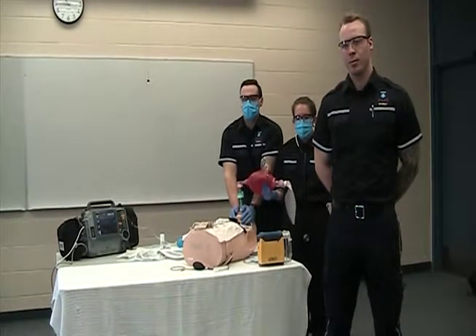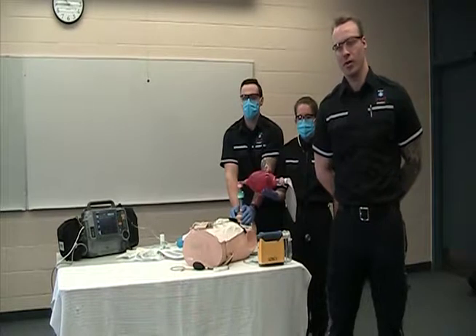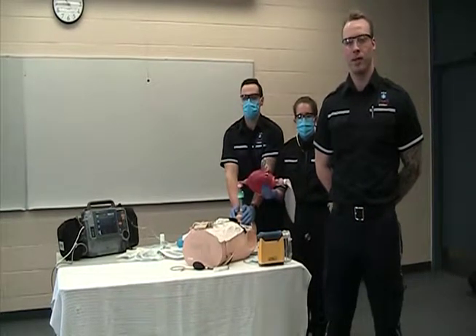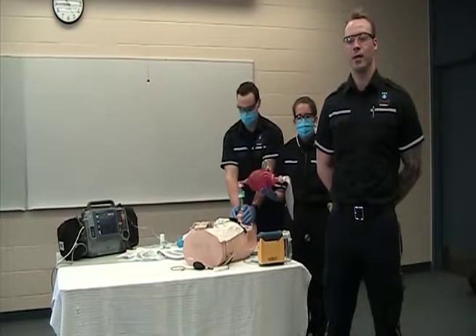Second thing we want to do is provide pre-oxygenation. So this involves a nasal cannula at 15 liters per minute in conjunction with an NRB or BVM at 15 liters per minute for 2 to 3 minutes.